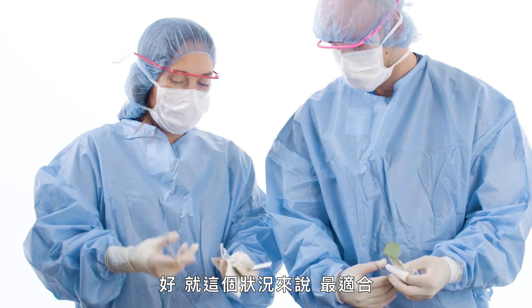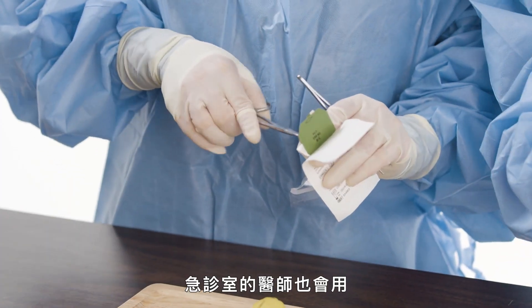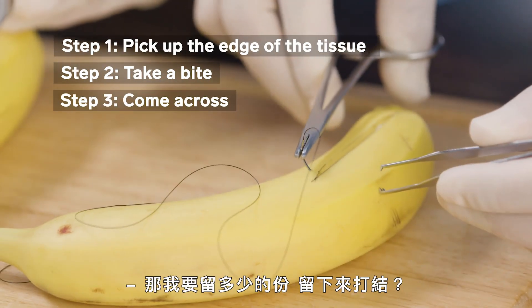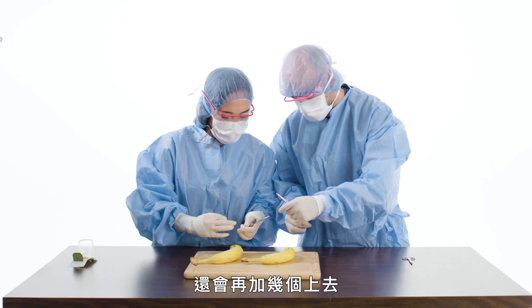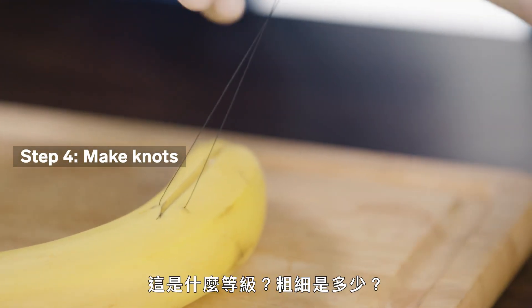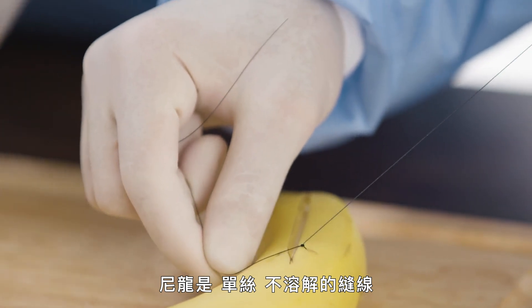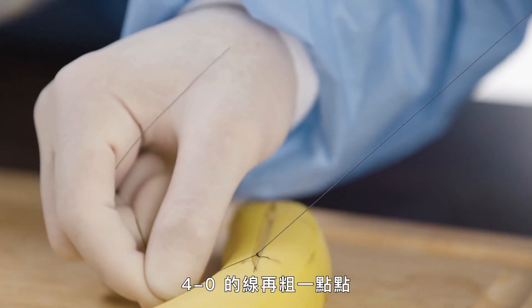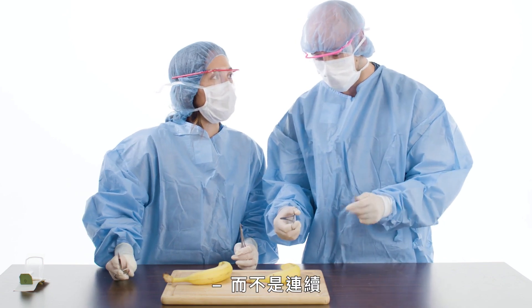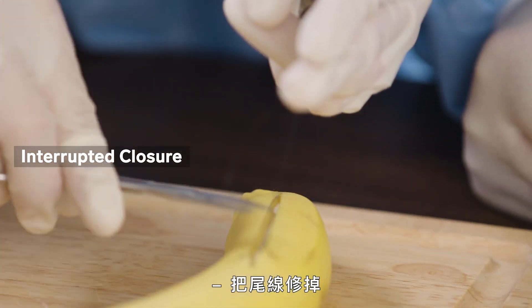For this model, it's best to close a banana laceration with a simple interrupted nylon suture. Orthopedic surgeons and ER docs will use it — it's a simpler, more straightforward way to close. Pick up on the skin, take a nice bite, come right across. Protect your needle. This is a 3-O nylon — a monofilament, non-absorbable suture, slightly larger than the 4-O you were just working with. Then trim your tails and put in a separate knot — that's the interrupted: each time as opposed to running. Cut the tails, start over.